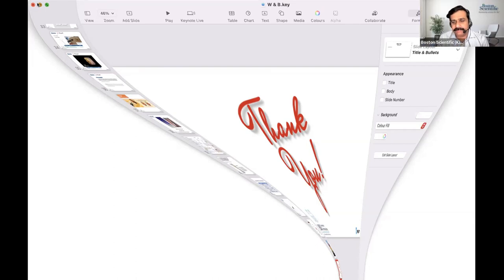Yes. Again, in lower pole stones, there are a couple of tricks in actually engaging the stone into your basket. As far as a zero tip basket is concerned, in a lower pole you would be opening the basket and struggling to engage the stone, because capturing a stone in the lower pole with a zero tip basket needs more refined hand movements. You would want the basket to engage the stone, either going under the stone or going above the stone or coming medially or laterally, all of which should happen in your hand.